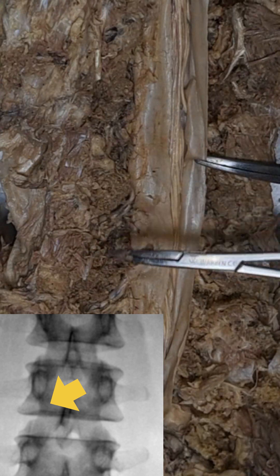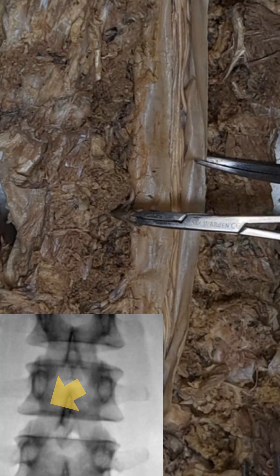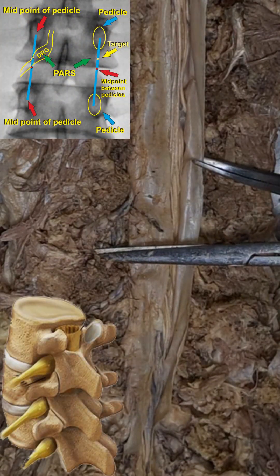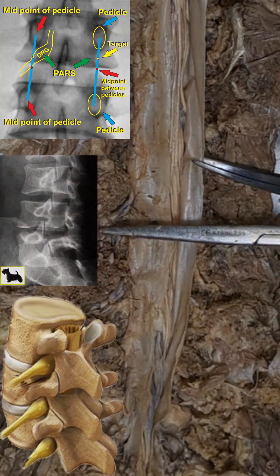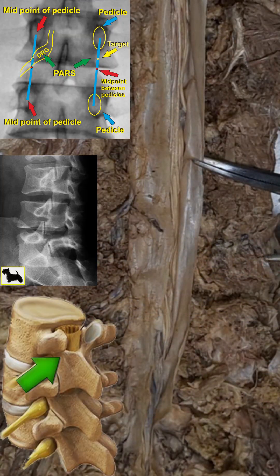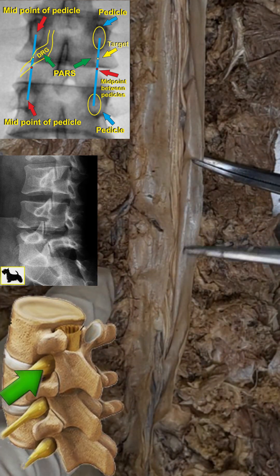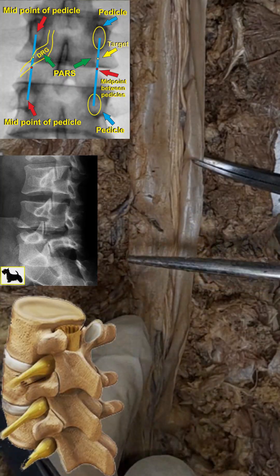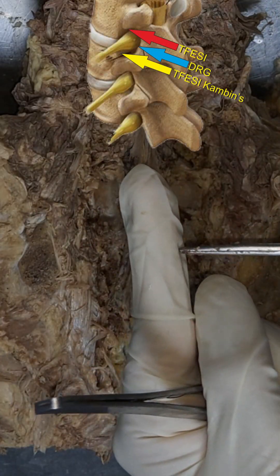For dorsal ganglion RF, the needle should not be exactly in the middle of the foramen — it will be a little up. After touching the pars, you have to come a little inside, so your entry point should be slightly oblique, not straight. Take a little oblique and hit the pars because that is the last bony point. Without knowing the depth, you cannot enter into the foramen. For pulse RF of the dorsal ganglion, the needle has to be posterior to the dorsal ganglion.